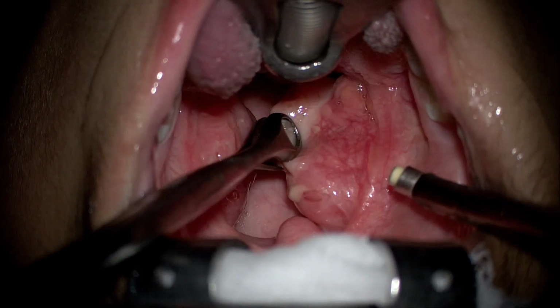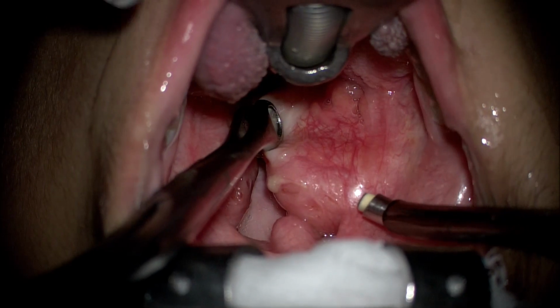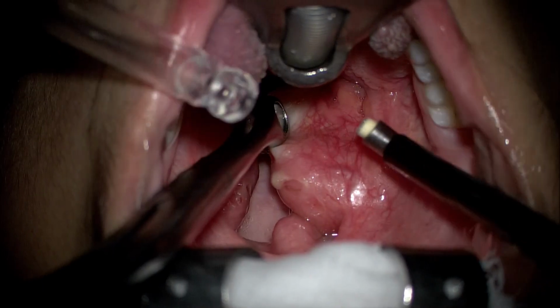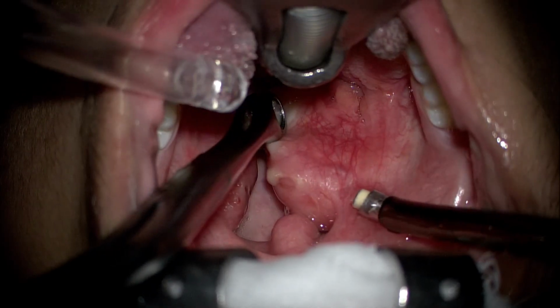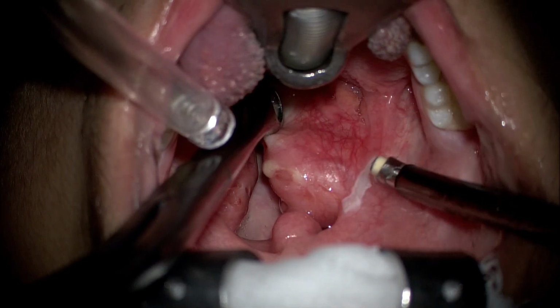This is the demonstration of a coblation assisted tonsillectomy, that is an extracapsular tonsillectomy, for the indications of recurrent tonsillitis as well as sleep disordered breathing.